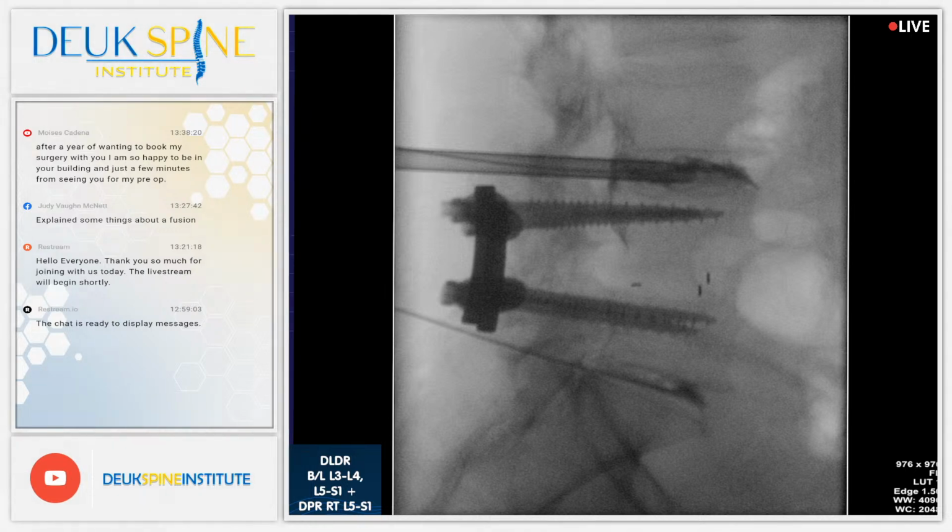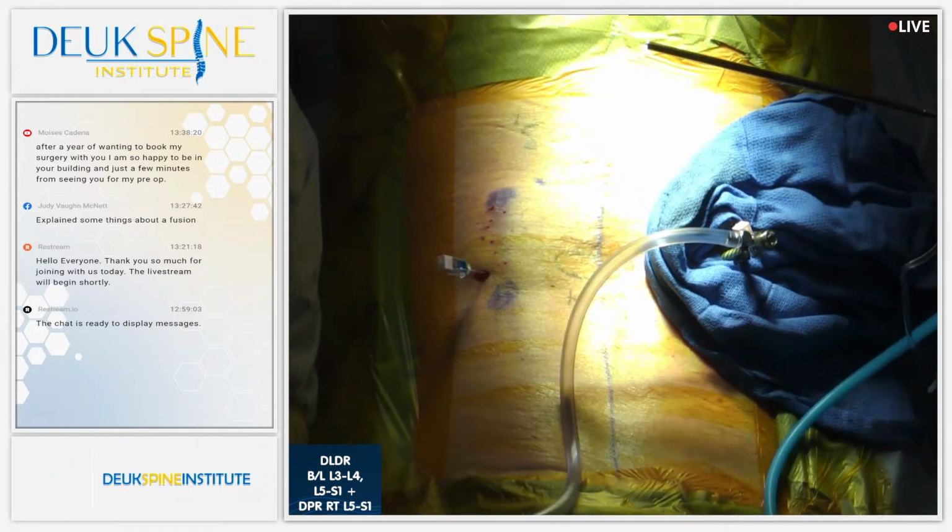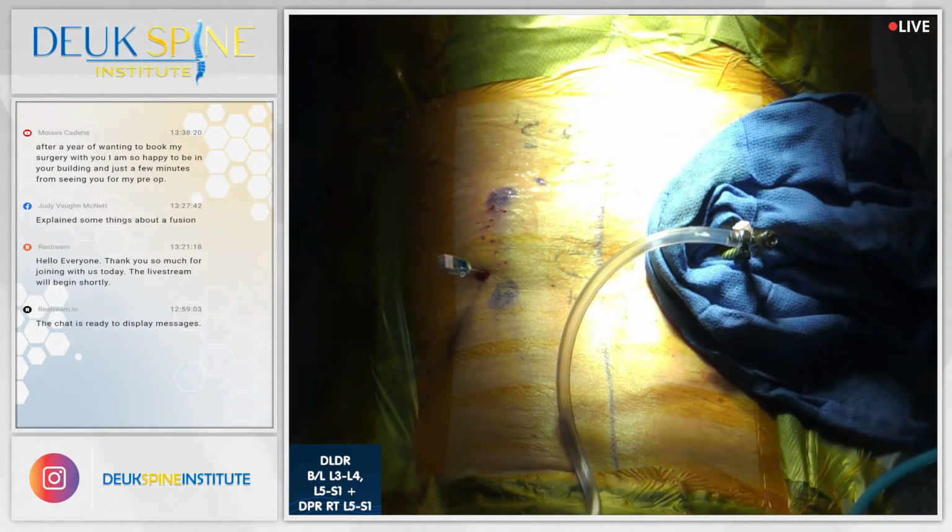But Deuk laser disc repair gets even better results. I think our average back pain relief on that paper was 85%. With Deuk laser disc repair, it's 100%. And that's with disc pain, of course, not other types of pain. Just disc pain. All right, any other questions?